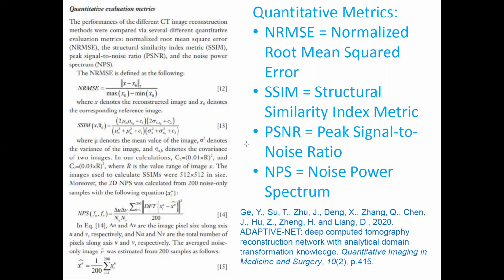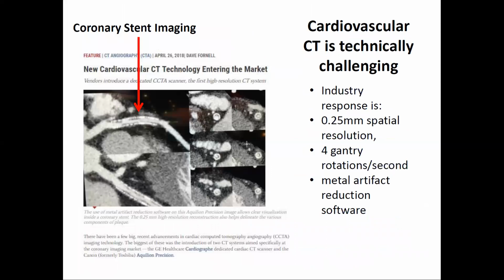I just wanted to make the point that the measures that you do on the phantom traditionally and classically, bearing especially on the noise power spectrum, are a subset of the useful things when you're talking about your imaging performance and trying to assess whether you're in fact improving matters in a quantitative sense. We'll come back to that point.